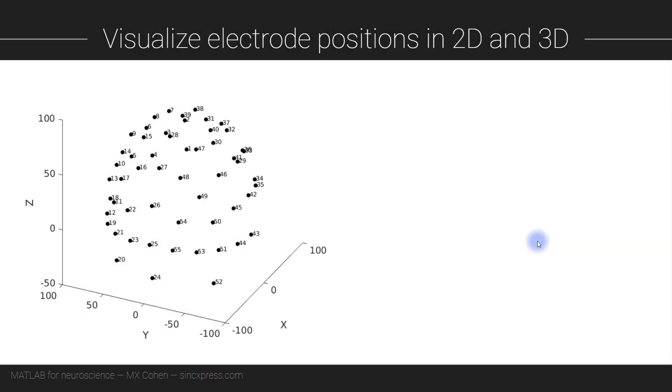The goals of this video are to import the data and understand the organization of the data structure, and then to visualize the physical electrode locations which will help us interpret the results a few videos from now.